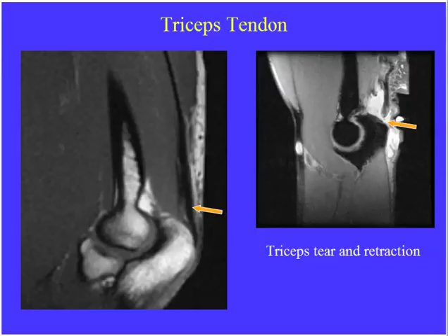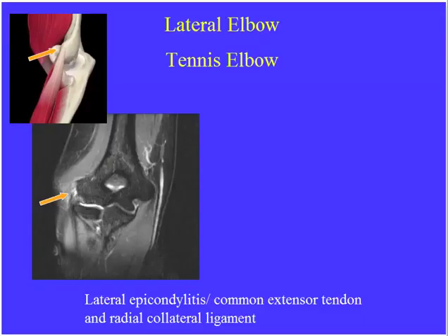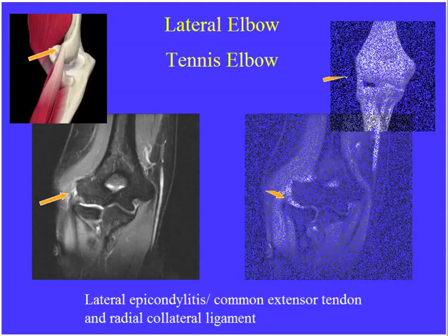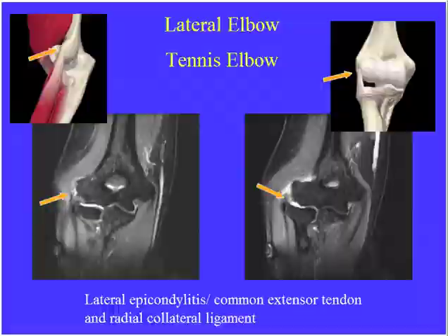They may also show triceps tendon disruption in the sagittal plane — normal triceps tendon coming down and inserting into the olecranon, with a full thickness tear and adjacent edema. For medial and lateral epicondylitis: along the lateral elbow, the common extensor tendon inserts into the lateral epicondyle. Normally this is completely dark — a tendon should be black on T1 and T2. High signal within the tendon at its insertion site indicates partial or full thickness tear. Often associated with common extensor tendinopathy is underlying radial collateral ligament injury, showing thickening and high signal.